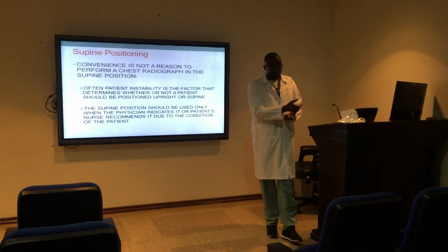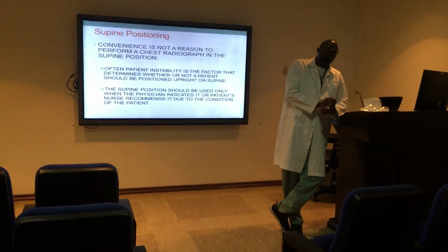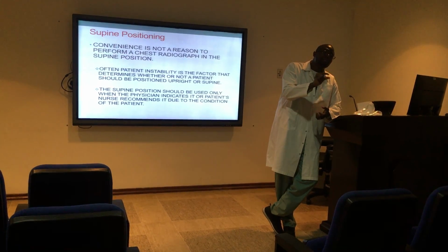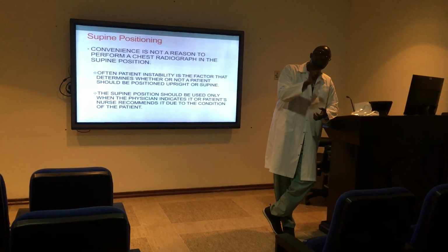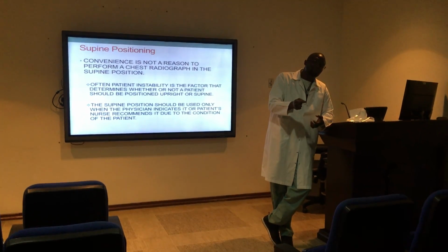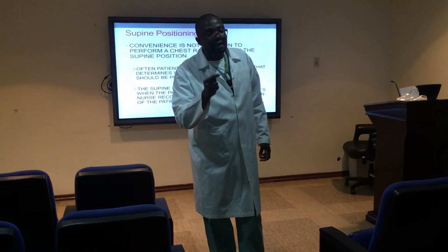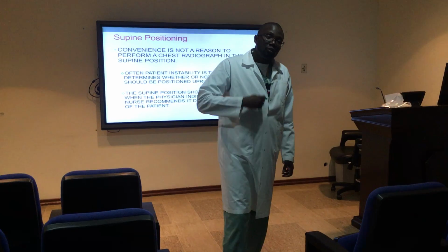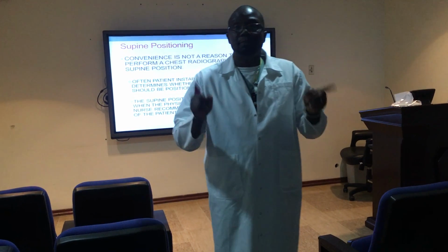As I said a few seconds ago, the patient condition is one of the determining factors whether the exam should be done supine or upright. And proper communication with the primary nurse is very important here. Again, don't just go into a patient's room without first communicating with the primary nurse.